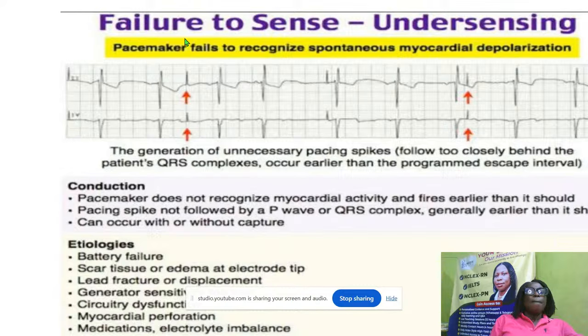This one is ventricular paced. This one is supposed to be ventricular paced. You can see where it is. Now, see where you have seen one ventricle here. I should have even used a closer diagram. Sorry. You have seen one ventricle here. The P that follows, this is missing.